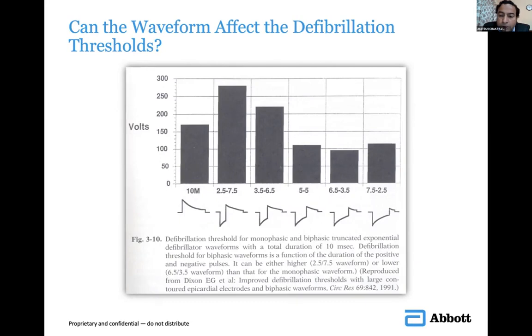Now, once you see the LA size on an echo, you can actually decide if your cardioversion is going to be successful, but everybody should be given one chance at cardioversion. An LA size between 4 to 4.5 to 5.5 is just about okay. When the LA size increases to more than 5.5, you're probably looking at a recurrence in the coming few weeks or months. So the higher the LA size is, the more chances that the cardioversion might not be effective for a long period of time.